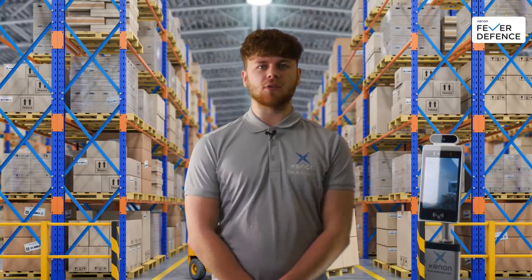Hi all, Ryan here again from Xenon Fever Defence. Next up on our tech support series, I will be looking at how to connect your device to the online portal.